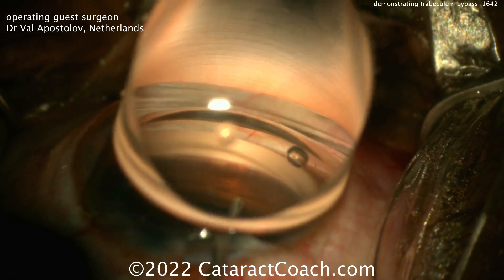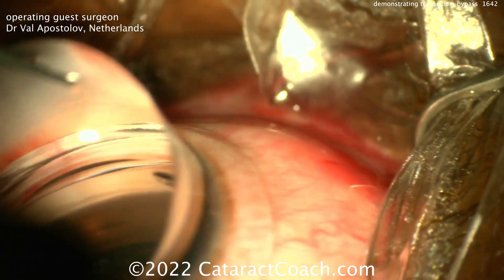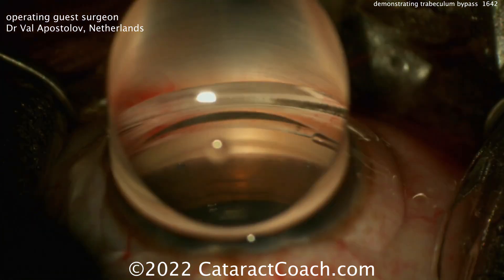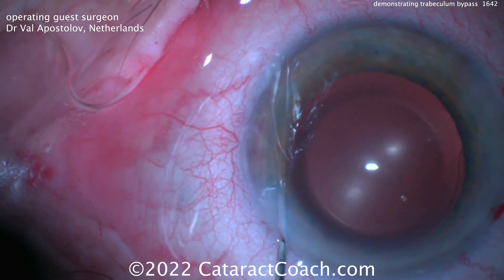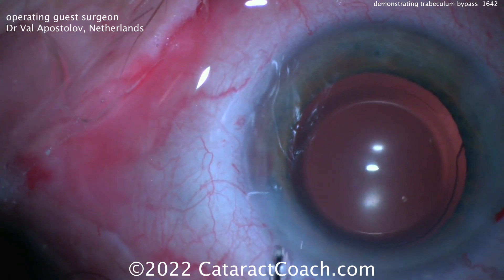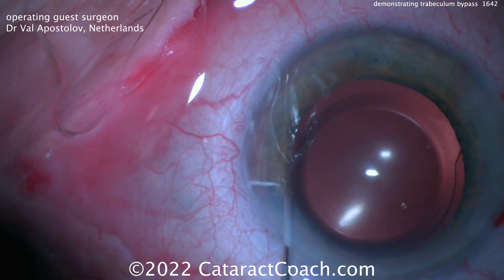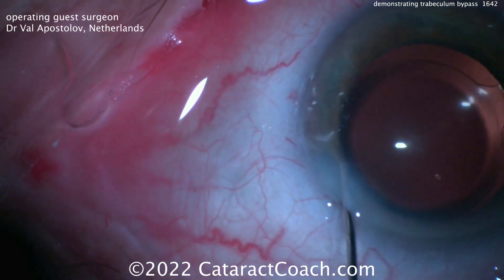You can see this is the eye stent that has two devices. There's one being placed there, and then about a clock hour — 30 degrees away — is the other device. And that looks great. So here's the demonstration. At the end of the case, a little bit of blood you see there on the angle is normal. Getting the IOP up and putting BSS in the eye, you can see it blanches those vessels right there.